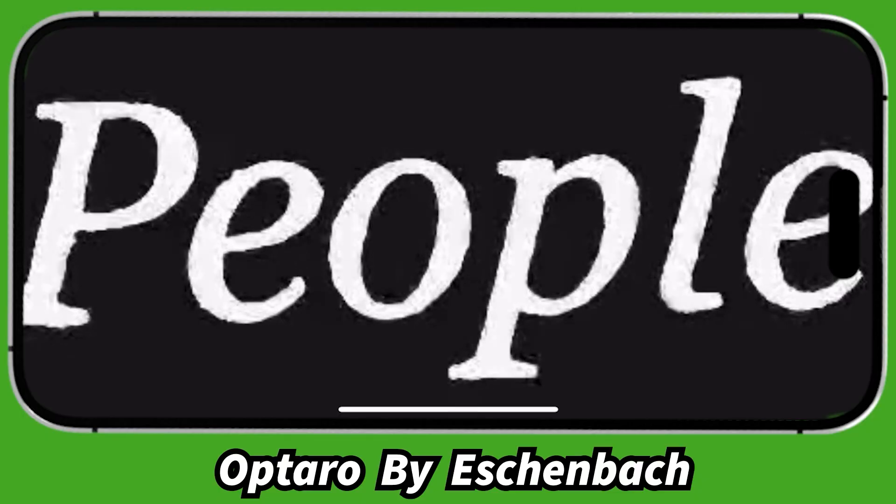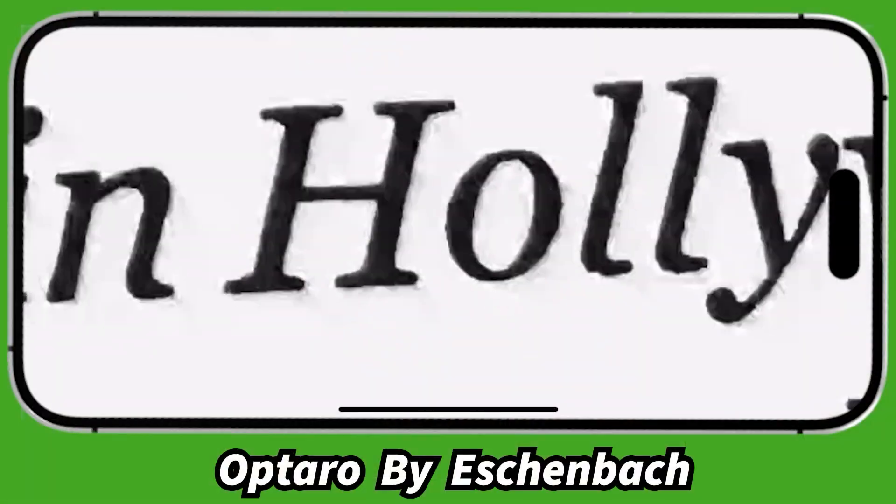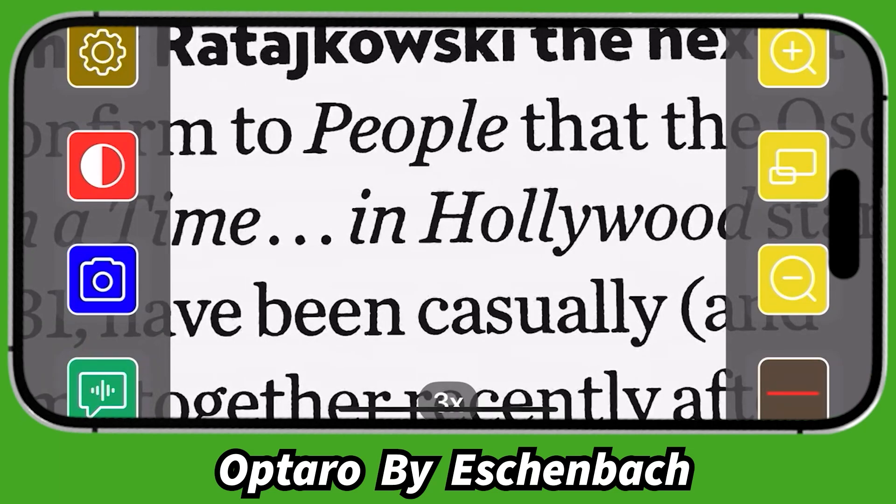It's got everything you'd expect from a handheld electronic magnifier, just utilizing the iPhone instead. Max magnification is 15 times. The image looks good, but there is a little bit of artifacting and ghosting going on — nothing that would prevent you from reading, but noticeable. We were told it's 60 frames per second and it does seem pretty smooth. It's got decent optics and is pretty easy to use, provided you can see those buttons on the screen, although they are accessible with VoiceOver. However, if you're using VoiceOver, this product probably isn't for you — the screen might be a little too small.